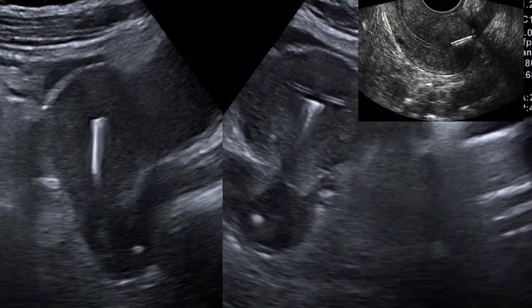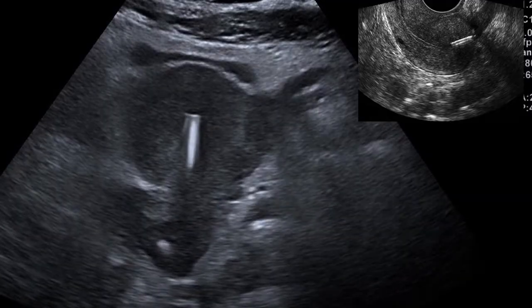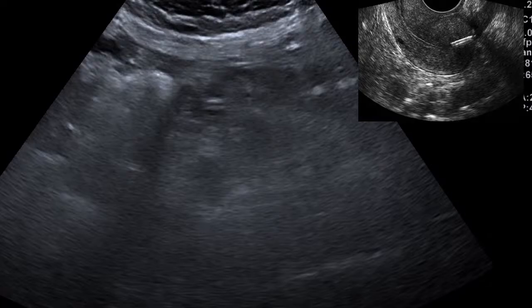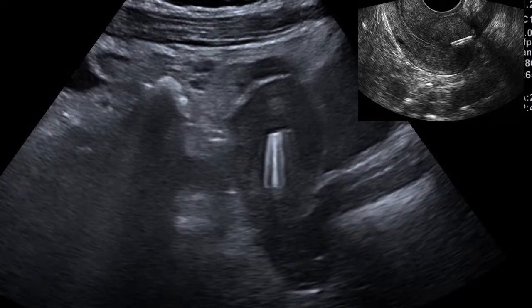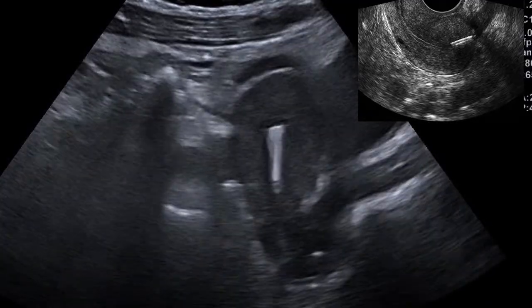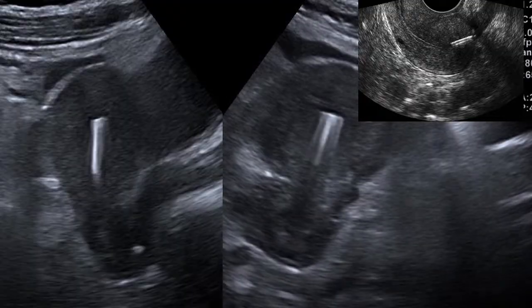The assessment of the IUCD position is very pertinent, very critical. As you can see there, you must check for the fundal position, then the arms of the IUCD. Let me show you the arms of the IUCD, that they are fully extended. Then the stem is centered. So this is the stem. So these are the arms.